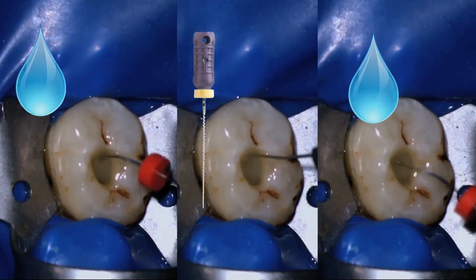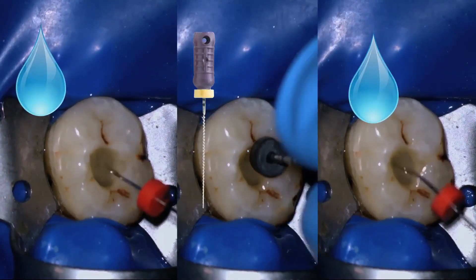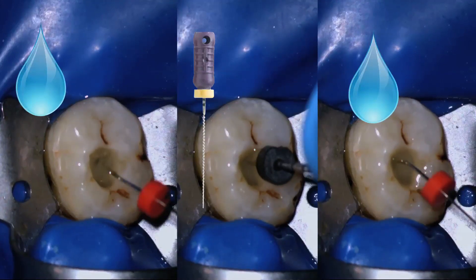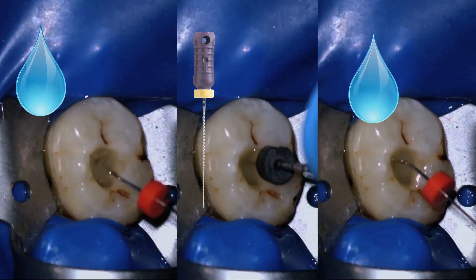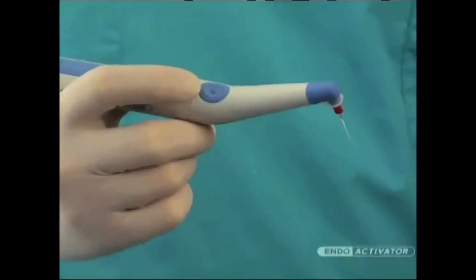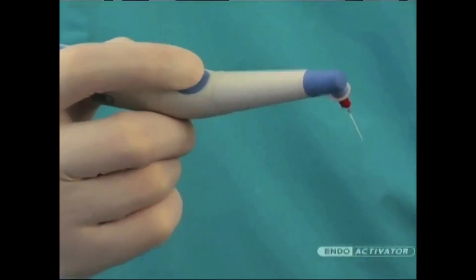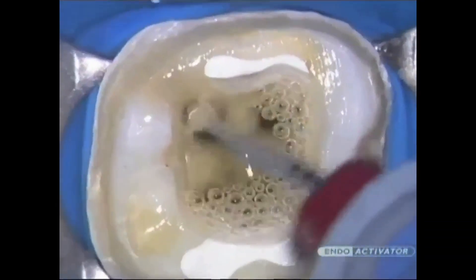The canal has now been prepared. We irrigate, make sure we have not blocked ourselves, and irrigate again. We make sure the canal has not been blocked and irrigate again. Now we proceed to use technology like the EndoActivator to remove the smear layer before obturating the canal. We can use solutions such as QMix in conjunction with the EndoActivator.